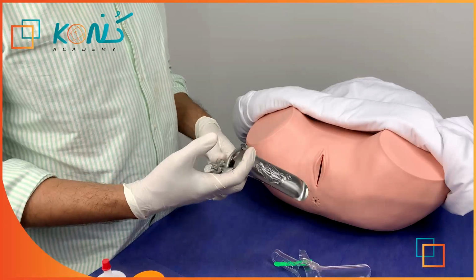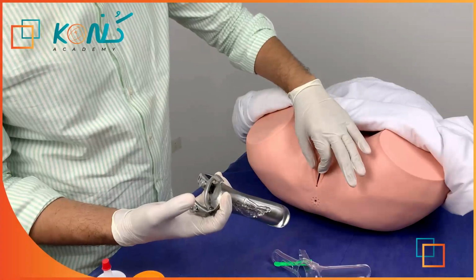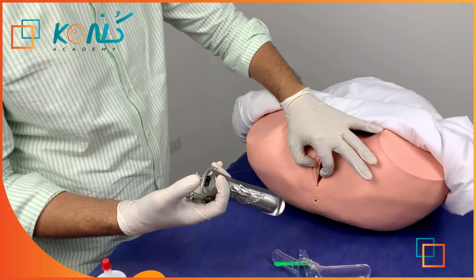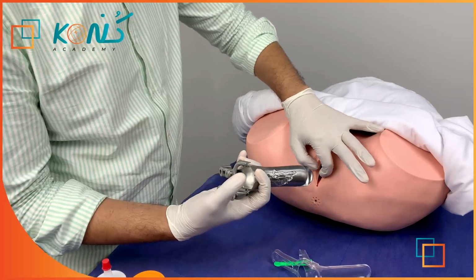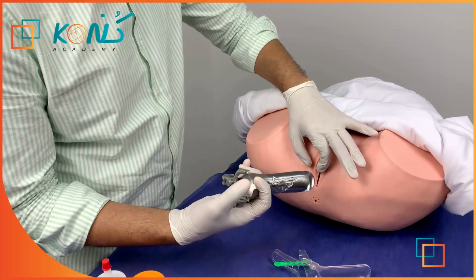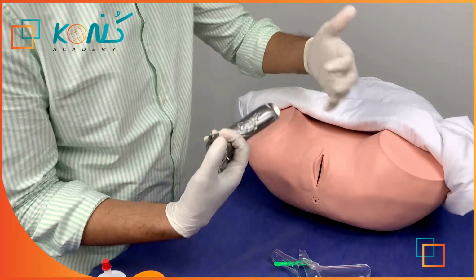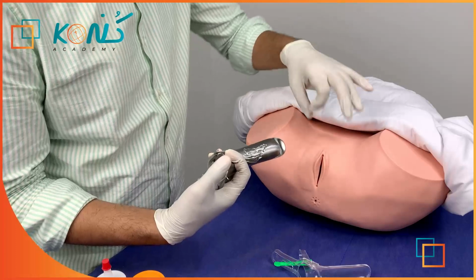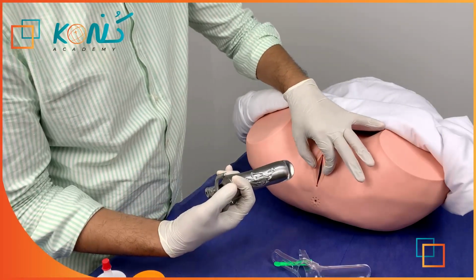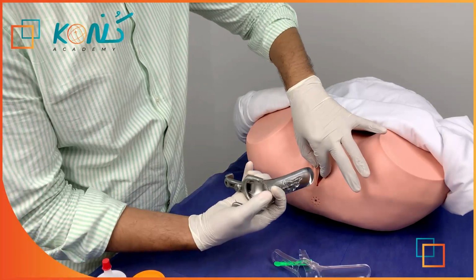So right now, we are lubricating it, we are holding it right now. How are we putting this? We are trying to separate both lips right now with my non-dominant hand like this. And let the patient know before doing it: Mrs., I'm about right now to put the speculum. Shall I proceed? Is it okay? Or if you even didn't want to take consent from her about this, it will be enough to say, I'm about right now to insert the speculum. You will separate both lips like this with your non-dominant hand. Okay?